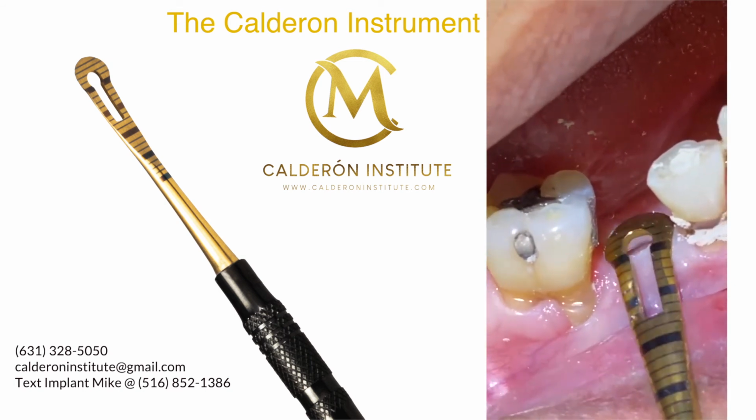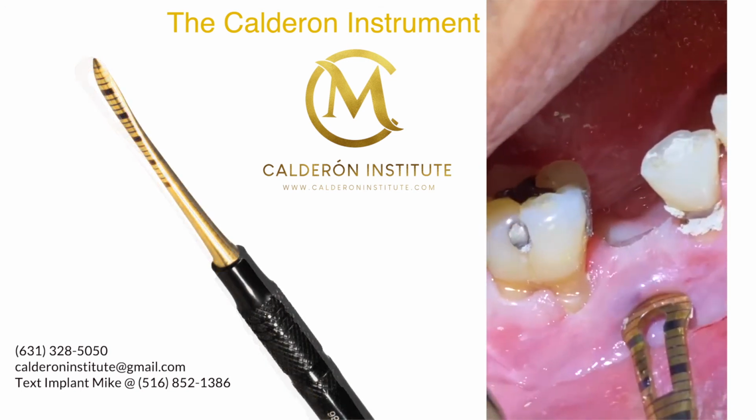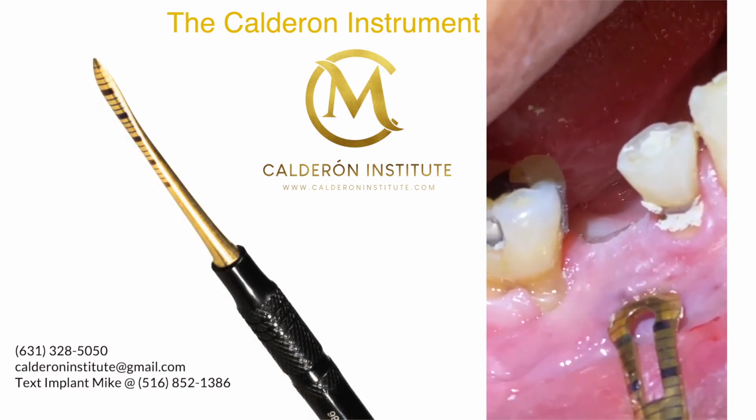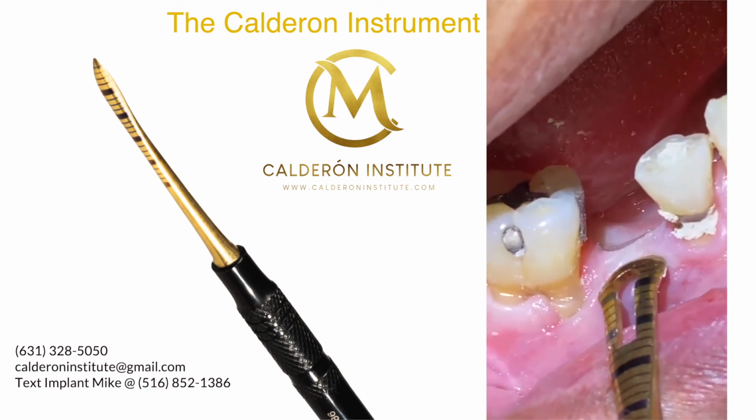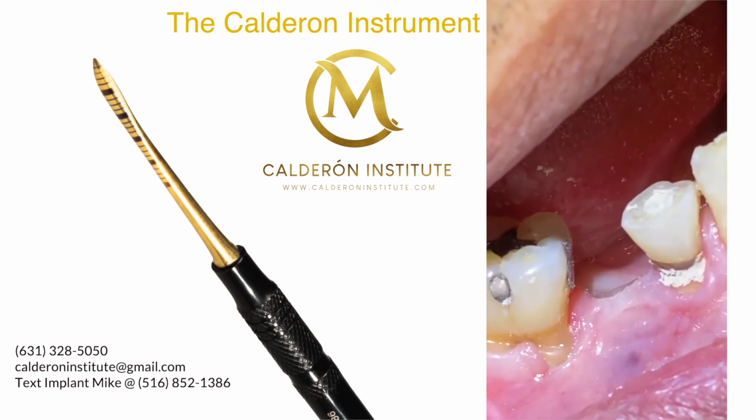So I'm already going to mark it. And look at that trusty keyhole there. I'm going to place it in there. Where's the connective tissue? Now you see where it's at. So it ends right here. So we don't have much room. I'll show you a little later how this is done as we're going forward. Take care.